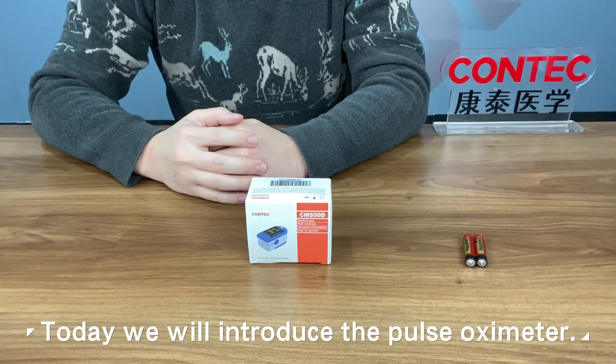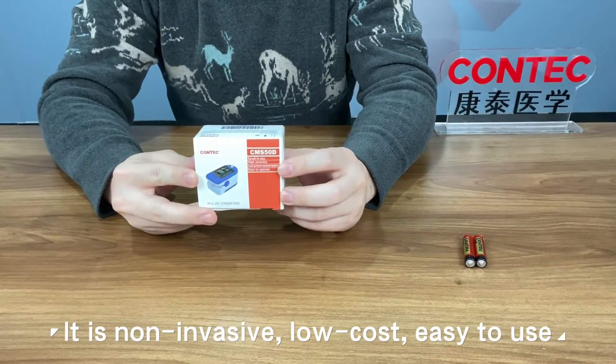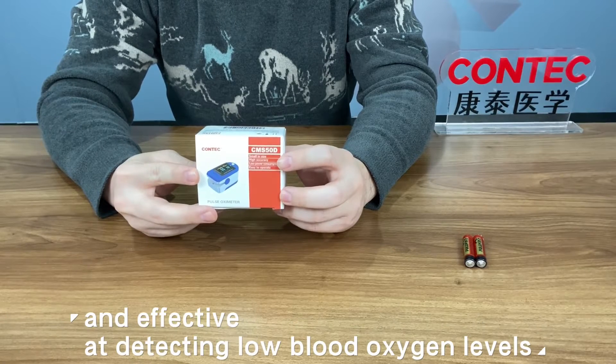Hello everyone. Today we will introduce the Pulse Oximeter. It is non-invasive, low cost, easy to use, and effective at detecting low blood oxygen levels.